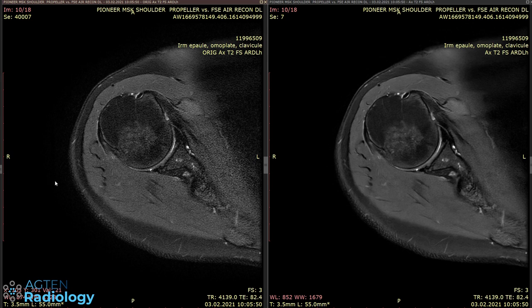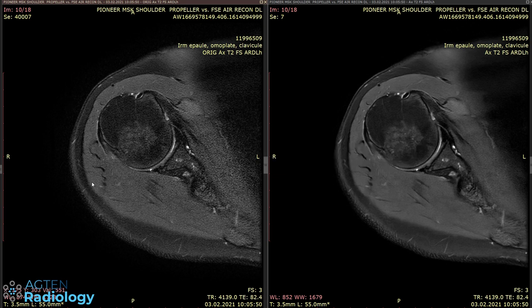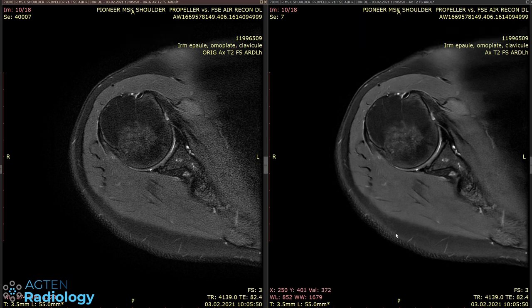Before we start with the first example, just a few notes. All the images were acquired with a GE Pioneer or Signa Pioneer 3 Tesla MR scanner. On your left-hand side is the normal image or normal sequence, and on your right-hand side it's the same sequence but enhanced with Air Recon DL — that explains the same timestamp. We will also have other opportunities to compare sequences in some examples.